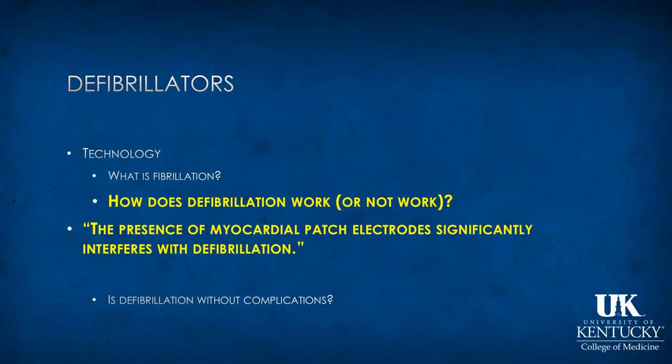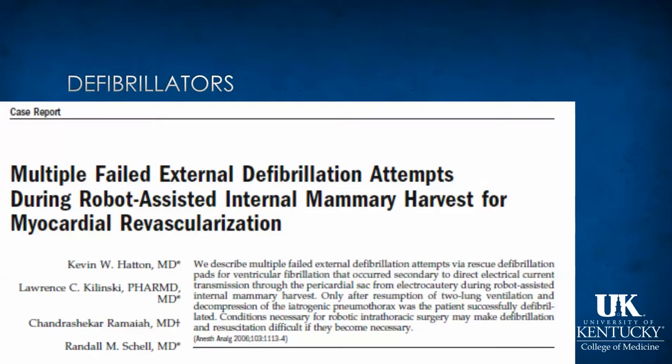A fact that I came up with in my search for information was that the presence of myocardial patch electrodes significantly interferes with defibrillation. What are myocardial patch electrodes? Well, at one time, implantable defibrillators had myocardial patch electrodes sewn onto the outside of the ventricle. And in this day and age, they're largely implantable defibrillator electrodes that are transvenous.